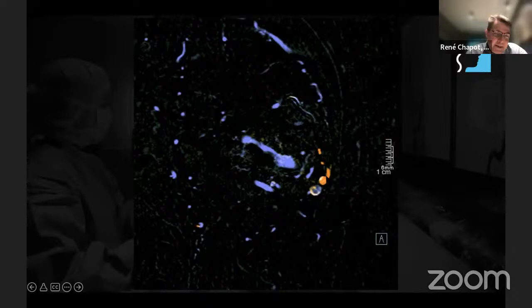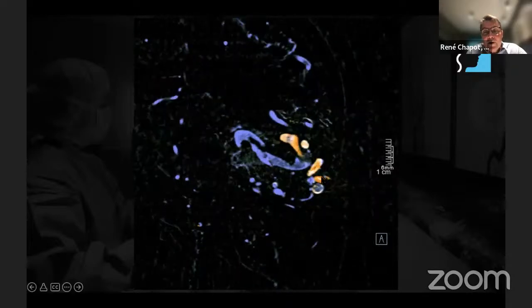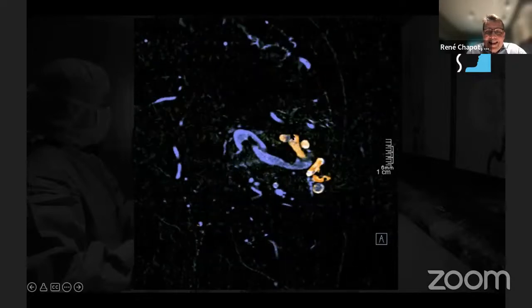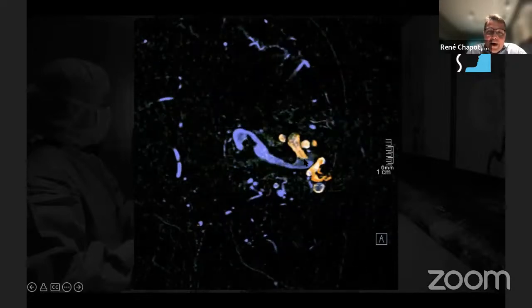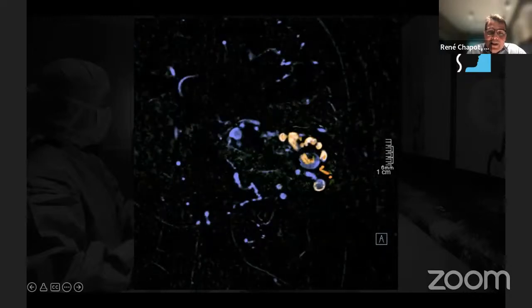And because of this, we can very precisely understand what's going on. We see that our microcatheter is somewhere here. This is a shunt that we're filling. And it is very clear that you see this vein arriving in the main outflow vein. You see how the contrast agent is diluting. Here's the main outflow vein of the AVM.